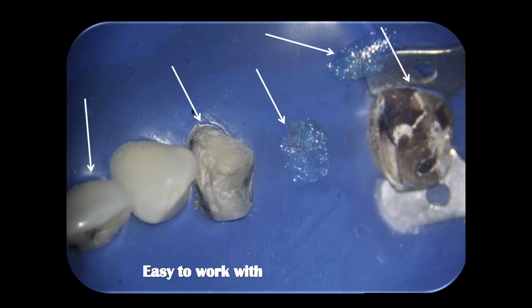Also, the amount of tension that can be produced in the sheet by reflecting it onto the rubber dam frame is different with a medium sheet and different with a heavy sheet. So this is another one. You can see I've done a quadrant isolation with a medium sheet, but then it will not give you that kind of retraction that a heavy sheet can give. So what will you look for when you buy your sheets?